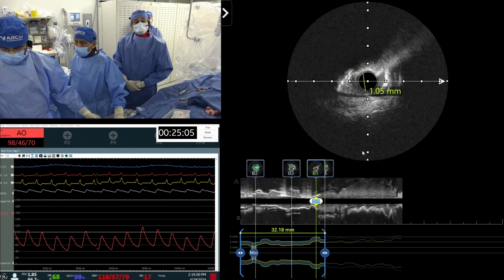You know, we're seeing some great live cases today, challenging here. And I can't agree more. Jazz, I did not do a lot of pre-IVUS until I finally listened to what you've been telling me for years. I had the same problem, doing more post-IVUS, to be honest with you. And you have convinced me.